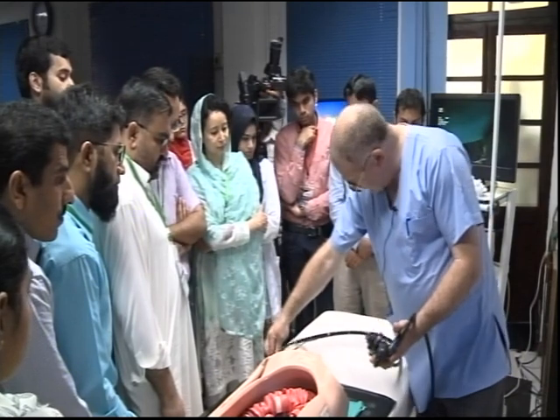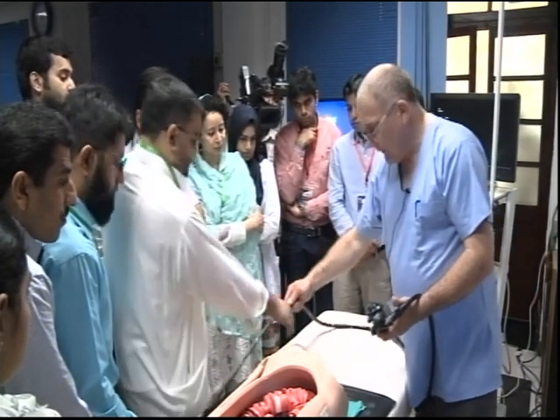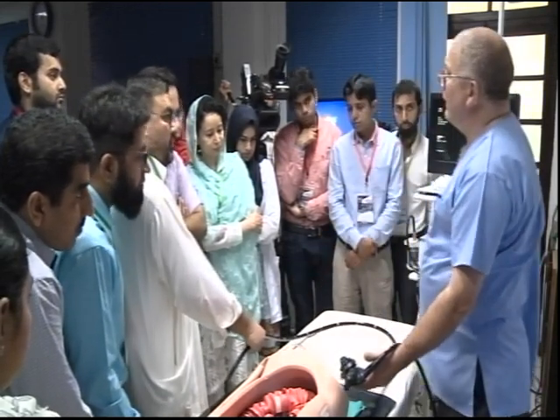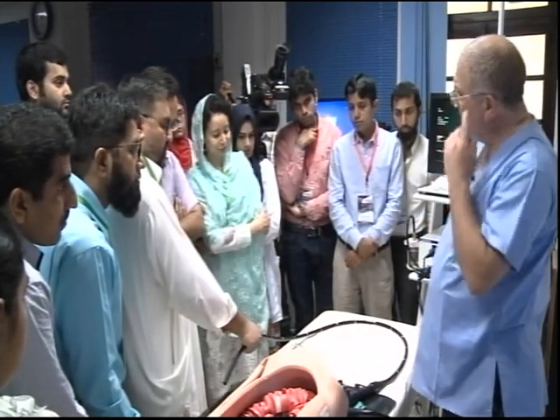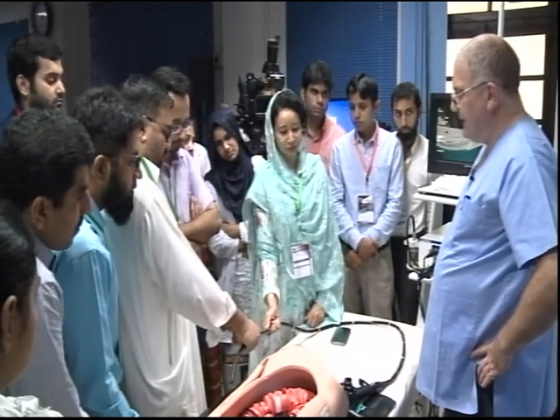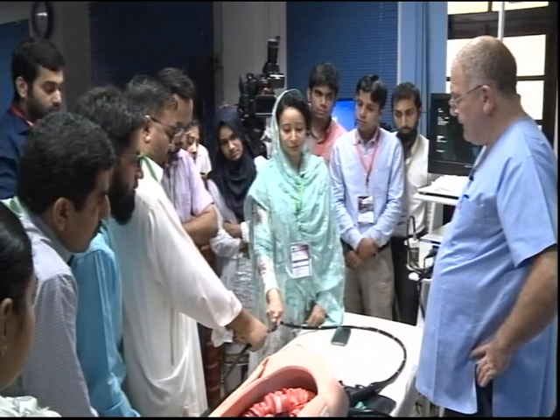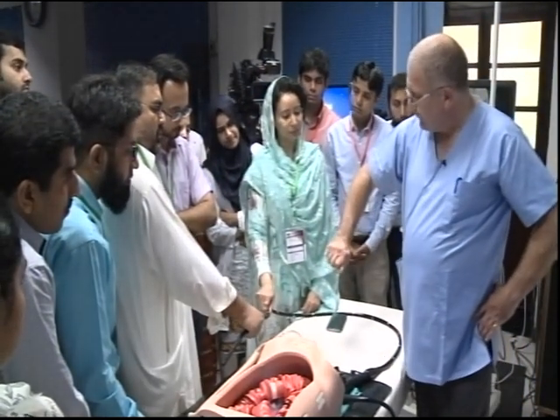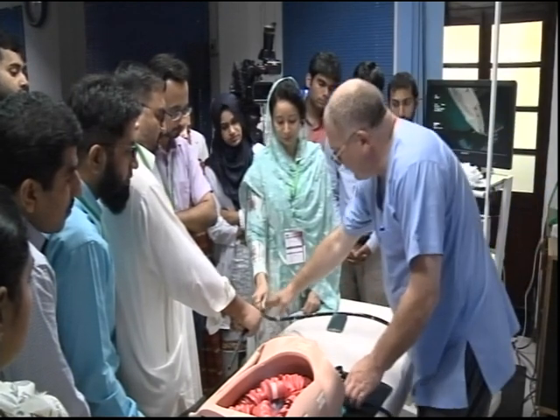So I want to go anti-clockwise. Hold the scope again. Hold it there in your hand. Put some anti-clockwise torque in the scope. That's clockwise. Anti-clockwise. How does that feel? Right. So what you're doing is that you're actually breaking your wrist to come round. Don't break your wrist to come round.